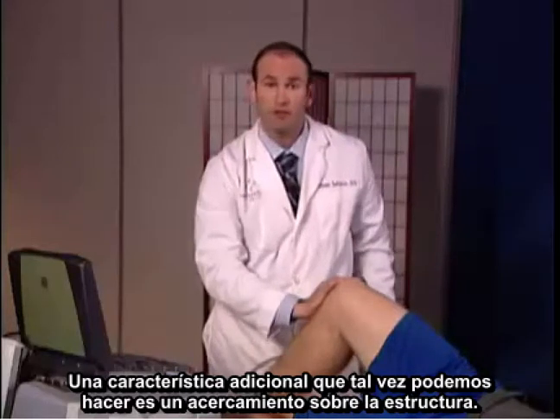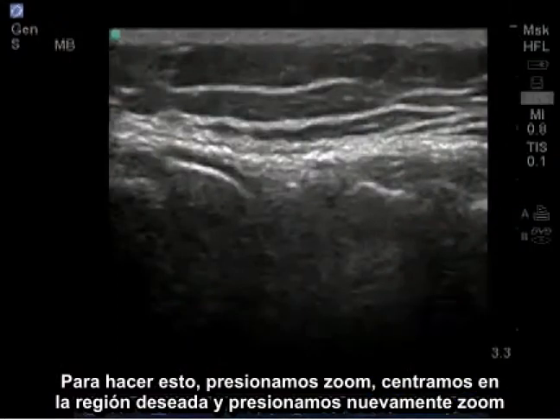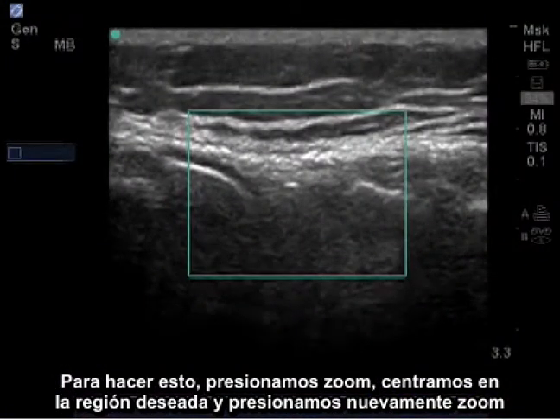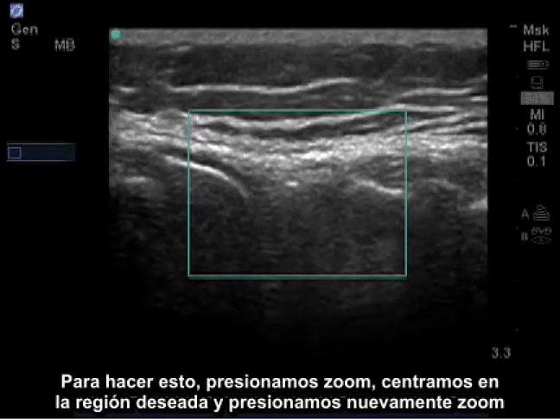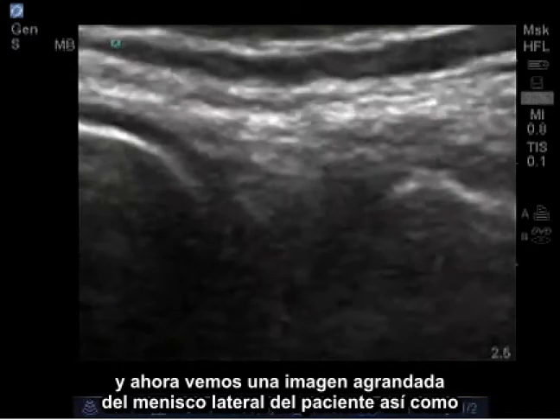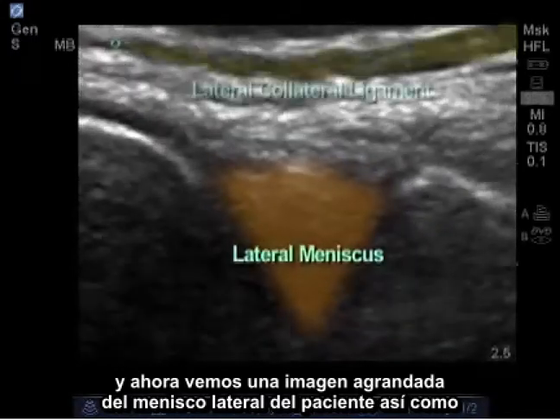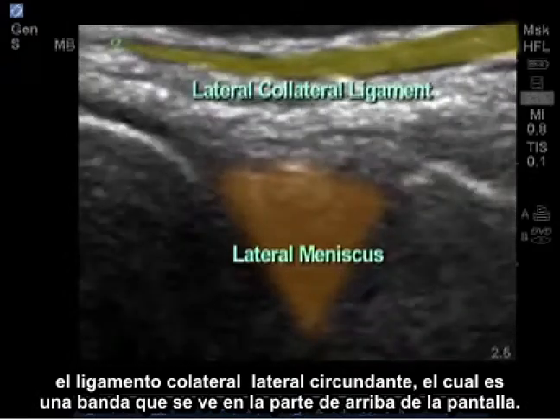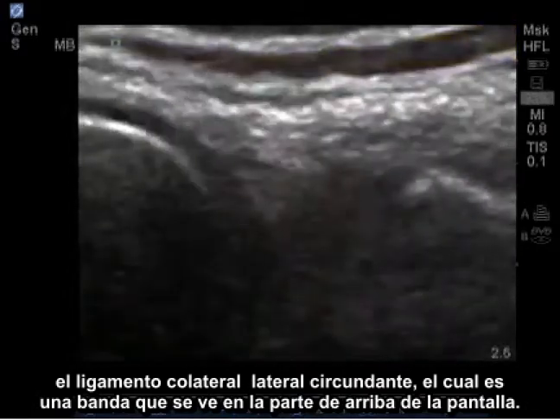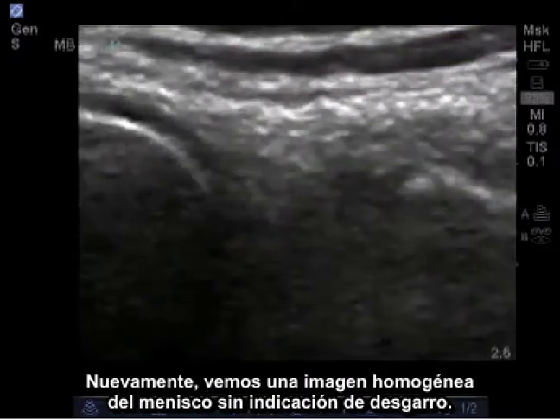An additional feature that we may be able to do is to zoom in on a structure. To do this, I'll press zoom, center over the desired region, and press zoom again. Now I have a blown-up image of the patient's lateral meniscus as well as the surrounding lateral collateral ligament, which is a band seen at the top of the screen — again showing a homogenous image of the meniscus with no indication of tearing.